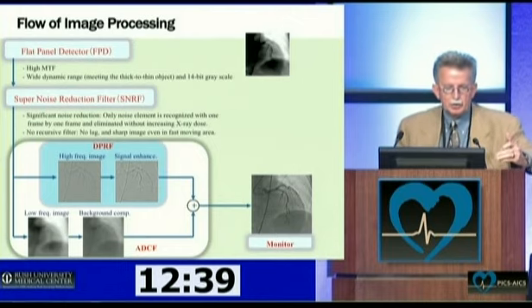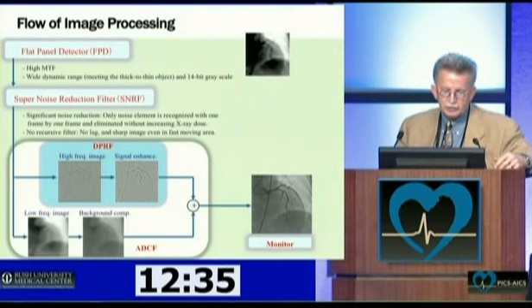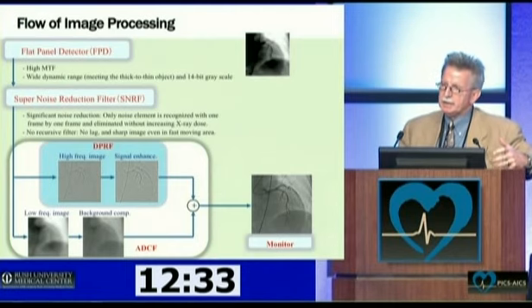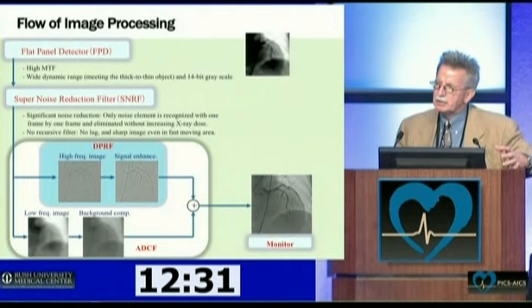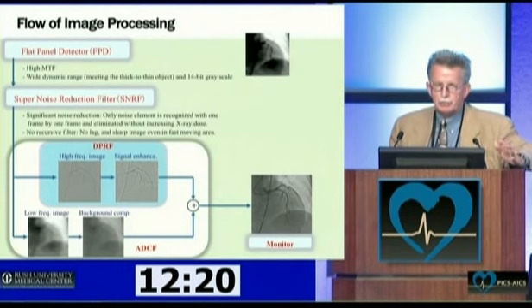And so we said, well, since we got flat panel detectors and went away from image intensifier, is there some way that we can continue to have excellent imaging, but at the same time reduce the dose? And one, quote, not simple way, but one way to do it, instead of doing digital acquisition, could we in fact be doing fluororecord? So our fluoroscopy was the same image quality as a digital acquisition.